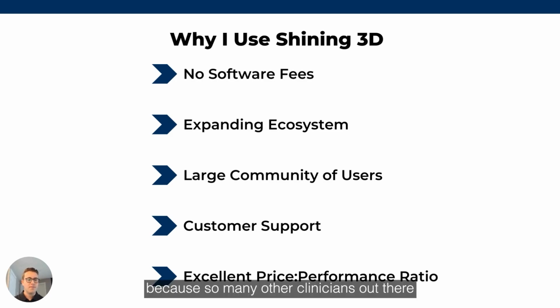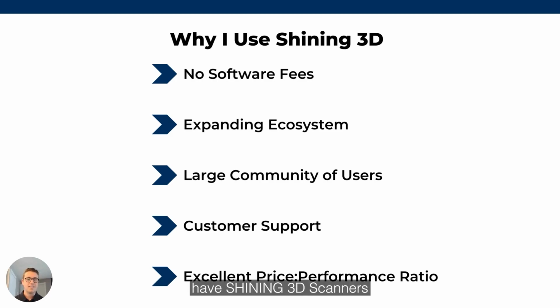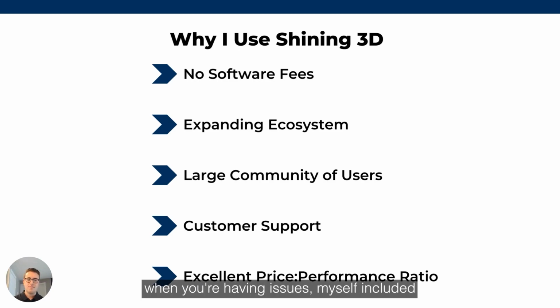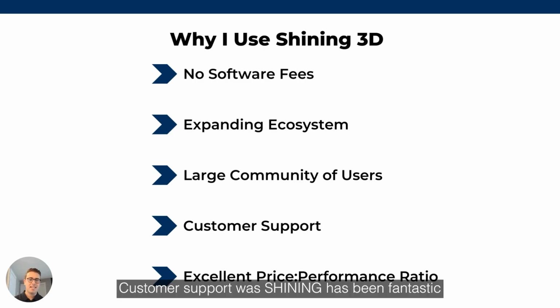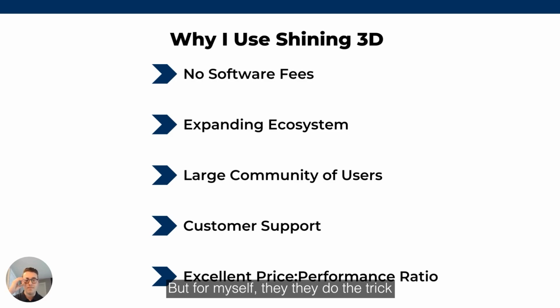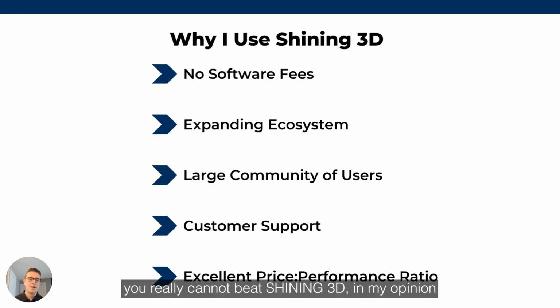Because so many other clinicians out there have Shining scanners, you can always reach out to one of them when you're having issues, myself included. Customer support with Shining has been fantastic. If you reach out to them, you always hear back within a day. If you need to hear back sooner, you probably want to reach out to your reseller. But for myself, they do the trick. And as far as the price to performance ratio goes, you really cannot beat Shining, in my opinion. You really do get a lot more than you pay for.